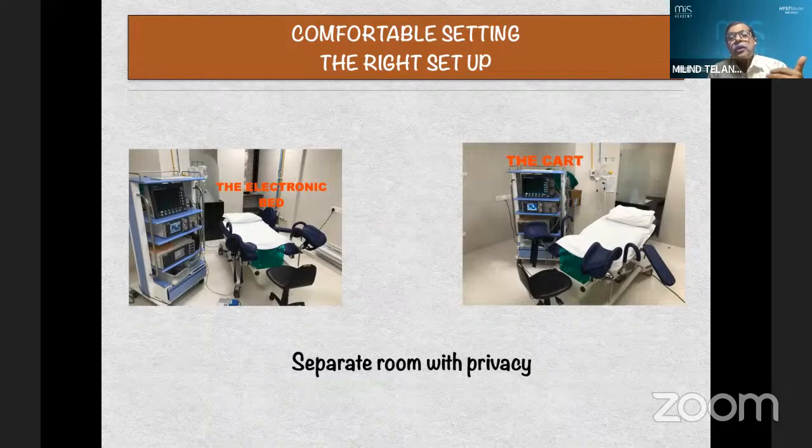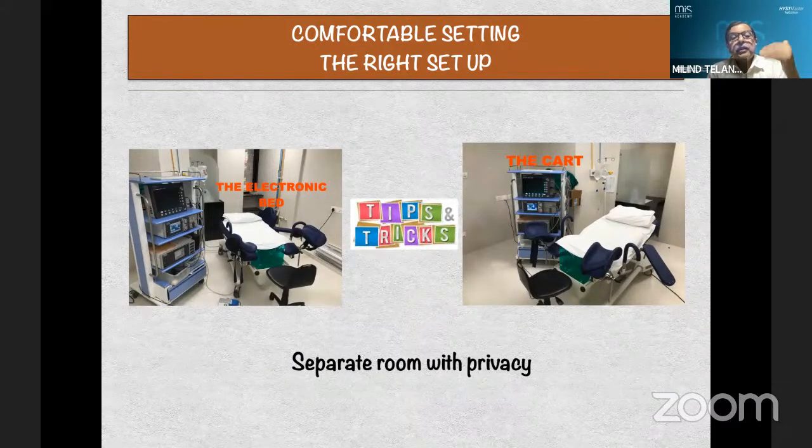So this is what is extremely important. That first step, that is to create a setup which is comfortable for the patient, respecting her privacy. Ideally, it should be near the toilet so that the patient can go and change. In fact, where I was in Bari, they never used to change. They were brought in their clothes and they sat on the chair directly. Only thing is, after finishing the procedure, they went to the toilet for changing.